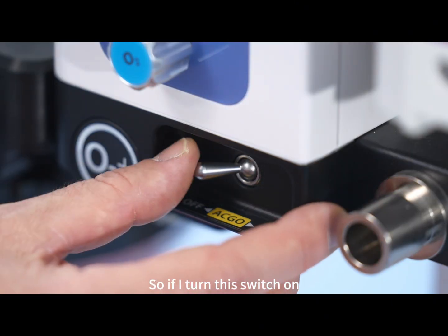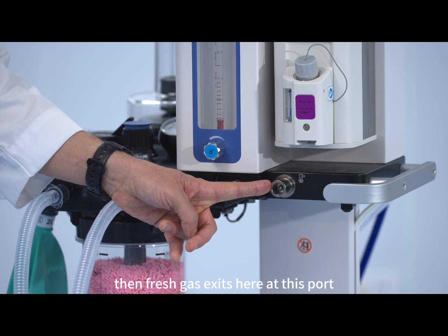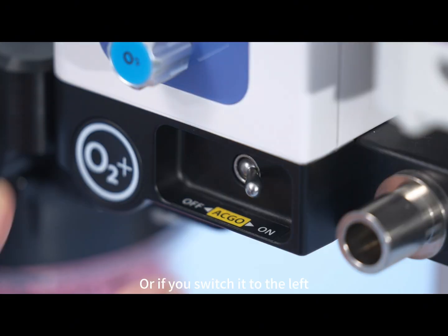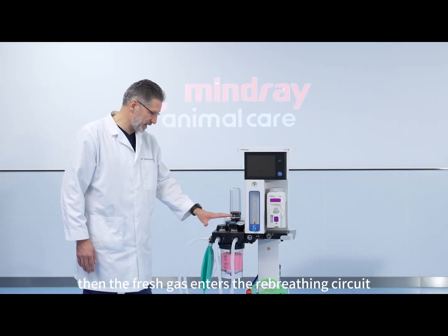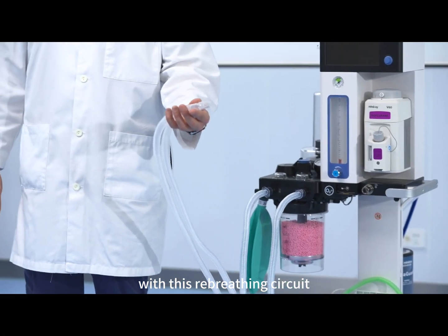So if I turn this switch on, then fresh gas exits here at this port. And you can anesthetize a parrot, for example, via a non-rebreathing system with a mask. Or if you switch it to the left, to the off position, then the fresh gas enters the rebreathing circuit and you can anesthetize your patient with this rebreathing circuit.